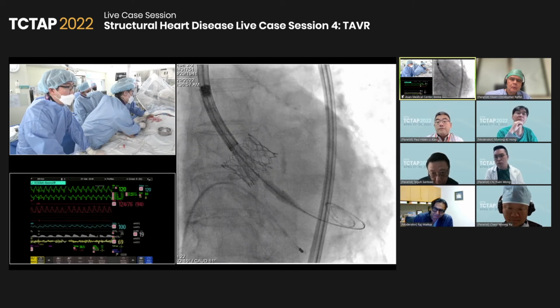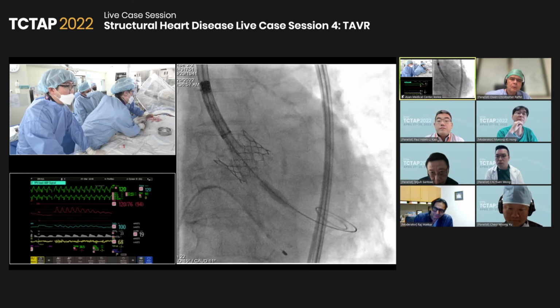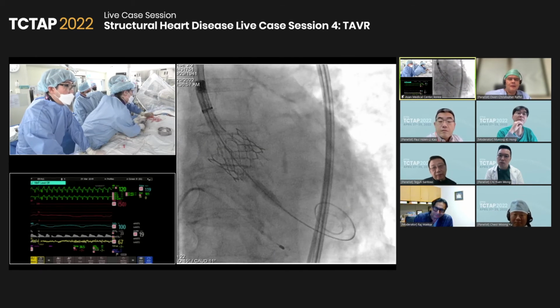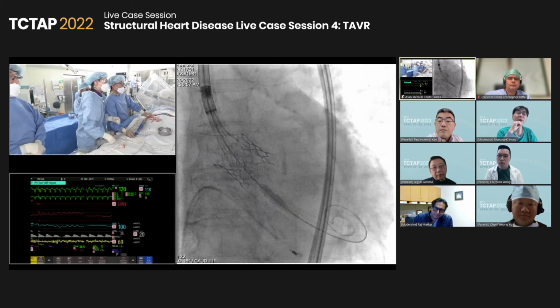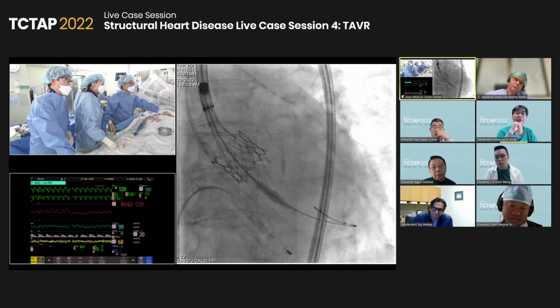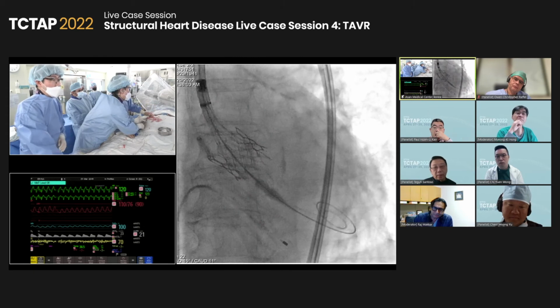Release, okay, release, then raise it up, release. This is good. That's okay. More release, let's release more. A little more release. I think it's so far so good. Yes. Technically, it's reasonable and acceptable. You can wind a little more. Wind. Unwind. Release, that's okay.